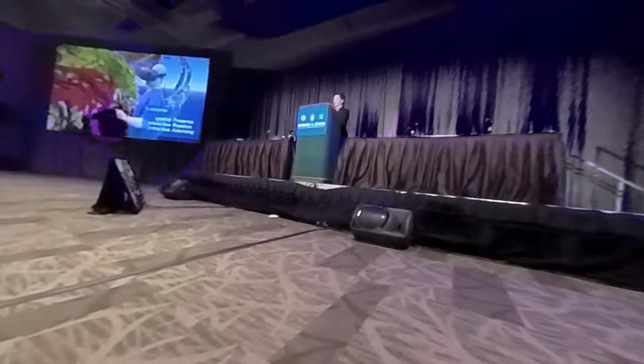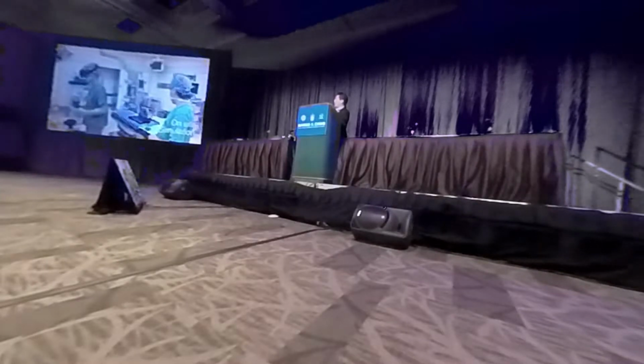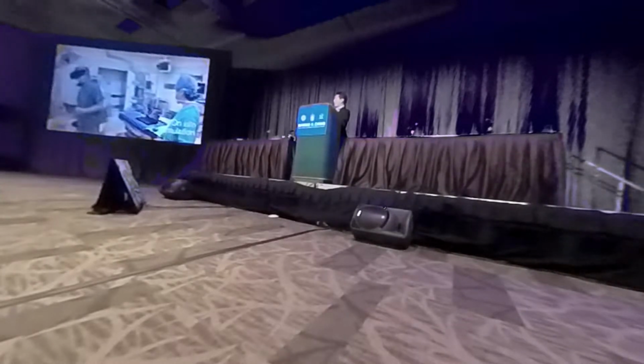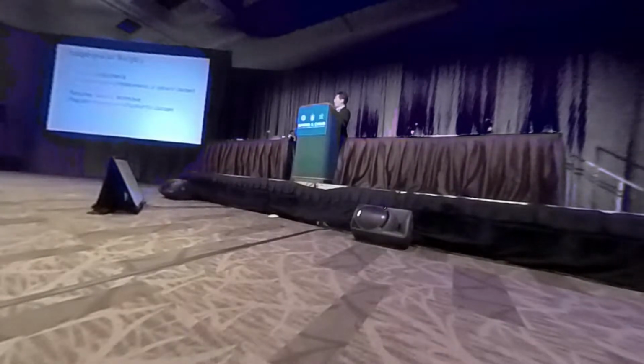Virtual reality needs three elements: spatial presence, interactive reaction, and immersive autonomy. And we are using this system in on-site simulation for young surgeons. They can learn and walk into a patient's anatomy before the surgery. So we need image-guided surgery. We need the tracking of instruments and the representation of instruments in patient data sets. And it requires tracking technique and registration of the patient to the data sets.